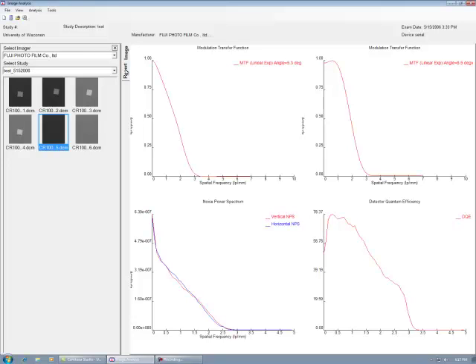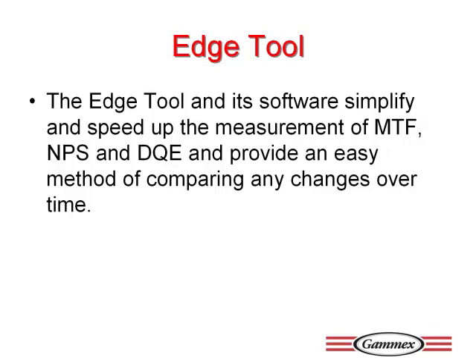If you want to print graphs, go to the File key and select Print. The Edge tool and corresponding software make the quality control aspect of DR and CR systems much easier to perform. They provide users with the tools necessary to generate comparative studies over time.